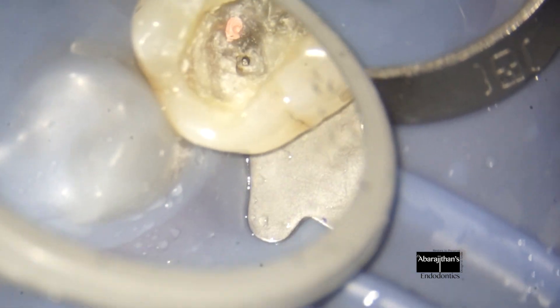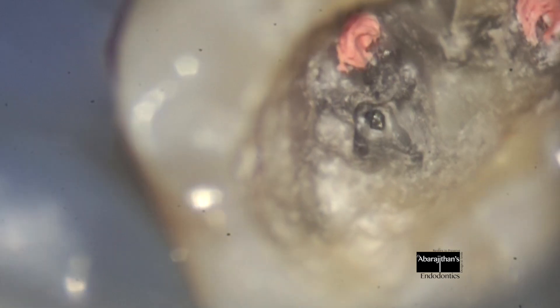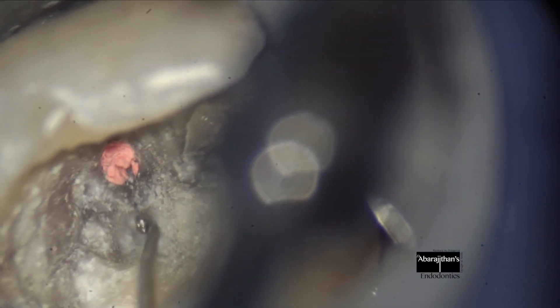So we start with exposing the instrument with ultrasonics first, and once the head of the instrument is seen, I start creating the staging platform. The aim is to expose at least two millimeters of the instrument.